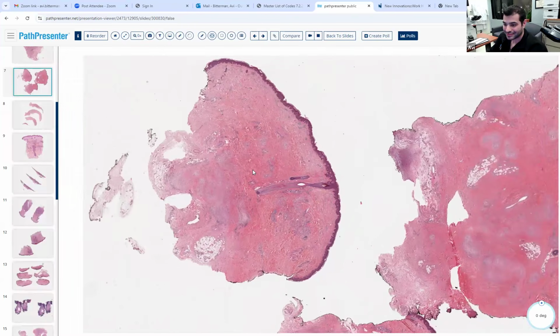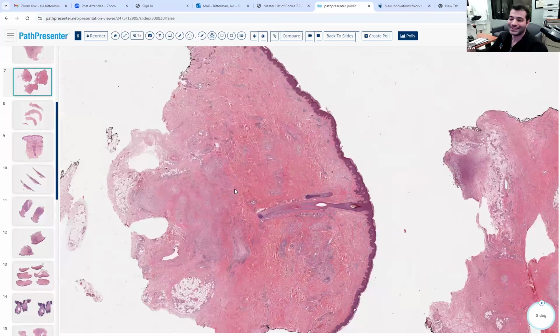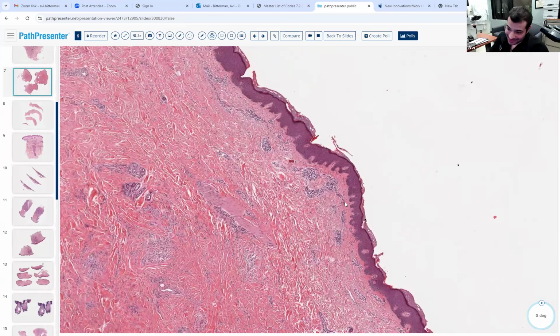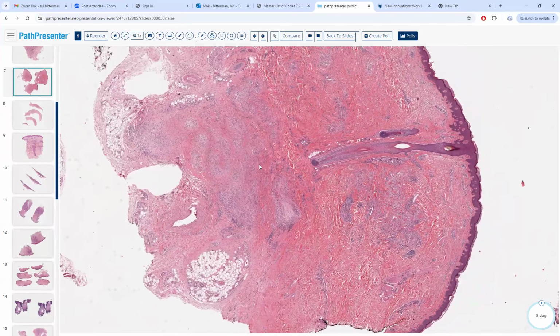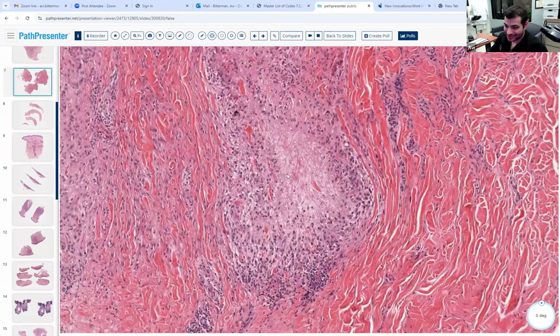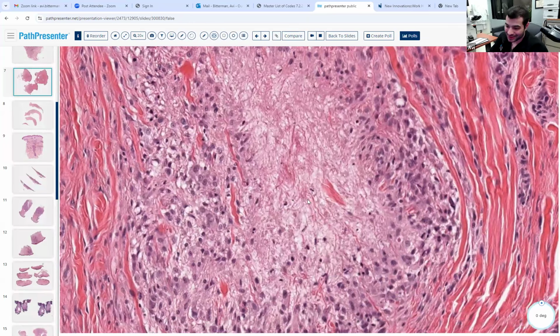And what's this? Another palisaded granuloma. I love it. Some superficial perivascular inflammation up top, palisaded granuloma down below. So what's our differential? GA. Deep GA. Rheumatoid nodule. We have to make a decision, okay? What are we thinking? More GA. This is all light. You can see that it's the mucin pushing apart the individual fibers. Yes, good.